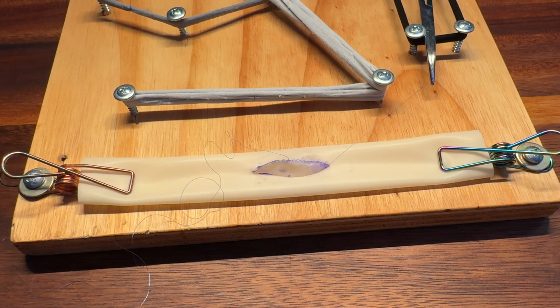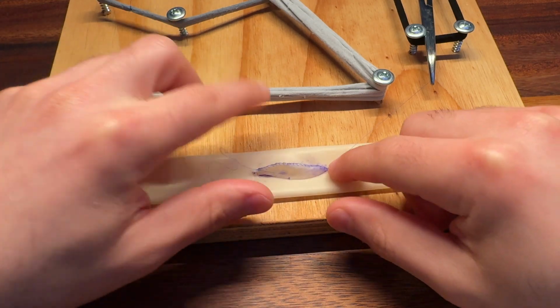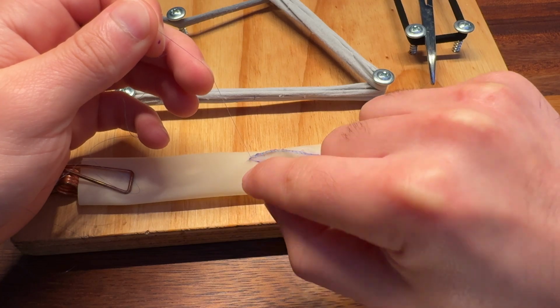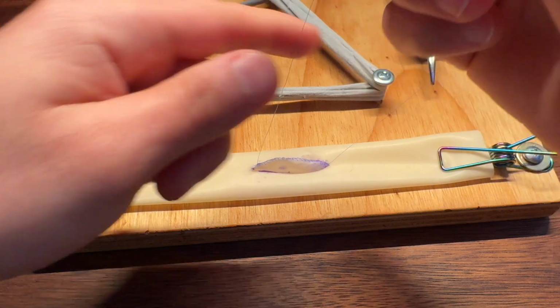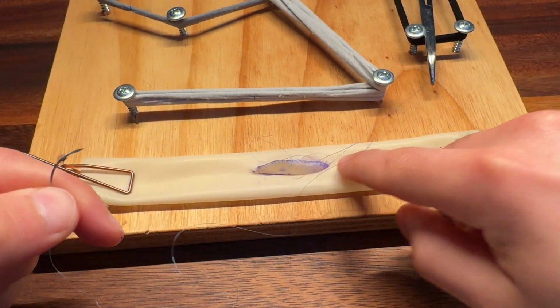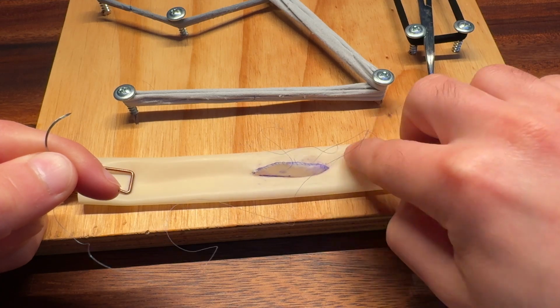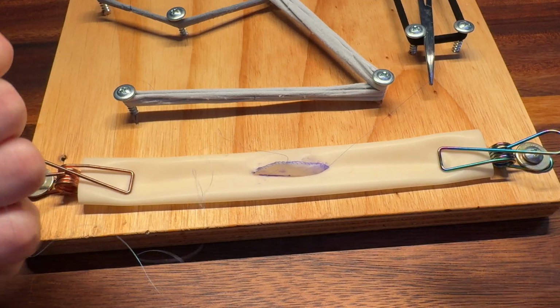Alright, so at this point of the patch angioplasty, I finished all the way down to the apex, right? And now I'm here. Since I'm outside of the blood vessel, I need to go into the blood vessel, but on the other side. So from now on, it's going to be a backhanded run all the way down to the very end. Once I get to the very end, I'll show you, but essentially you come out and then you're going to start tying knots with this string over here, and you're done. I mean, that's pretty much it.